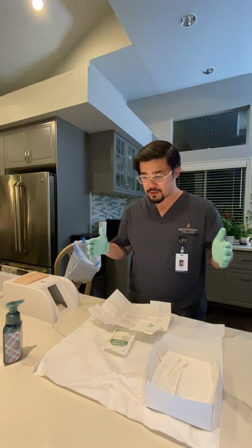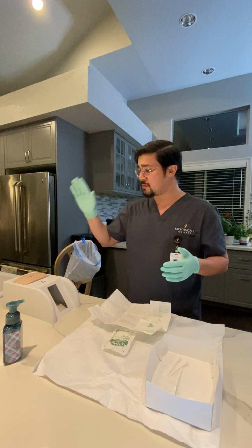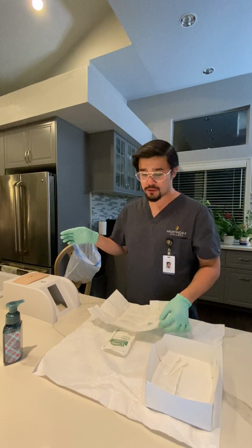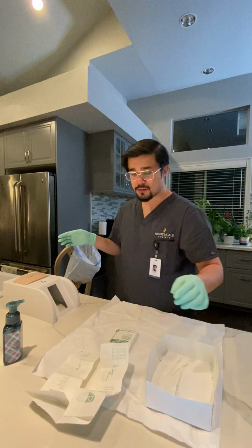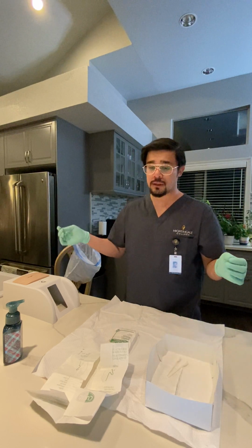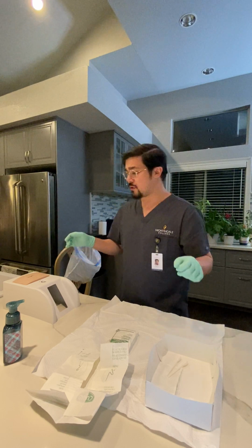Now, for the sake of maintaining the sterile environment, my right hand is going to be touching the patient. The left hand is going to be grabbing into the sterile tray, and it's going to maintain the sterile environment by not crossing or cross-contaminating from the wound and the sterile tray here.